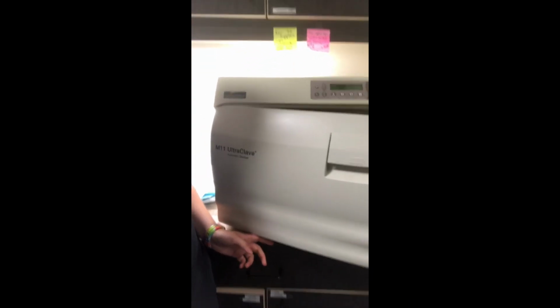So this is our autoclave. This is how we sterilize all of our instruments. It works by using distilled water that is heated electrically until the water is turned into steam, and the steam builds up pressure. That steam then sterilizes the instruments, and then once the process is done, the steam turns back into condensation and then back into water.